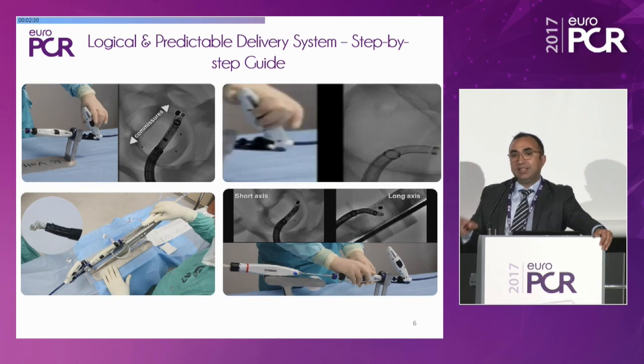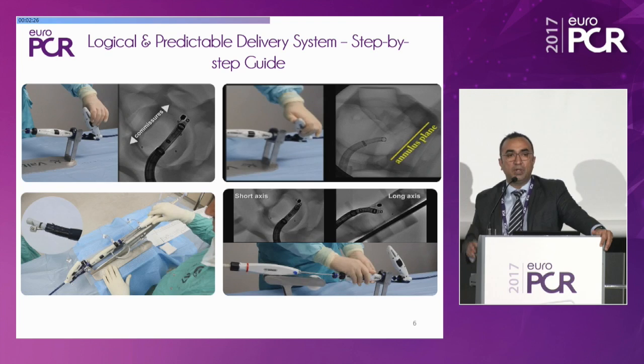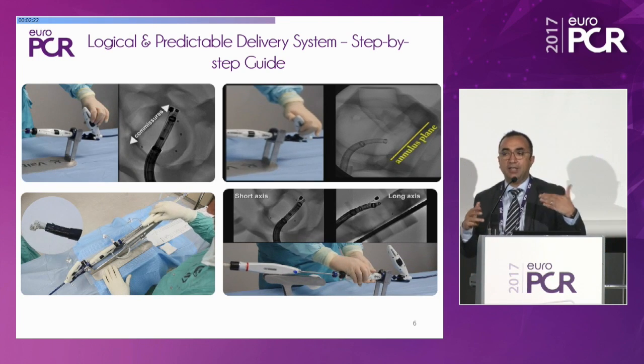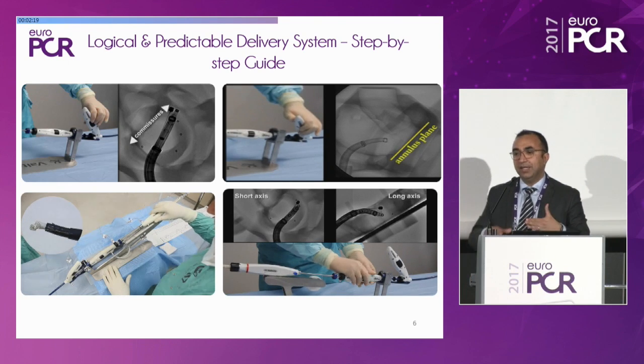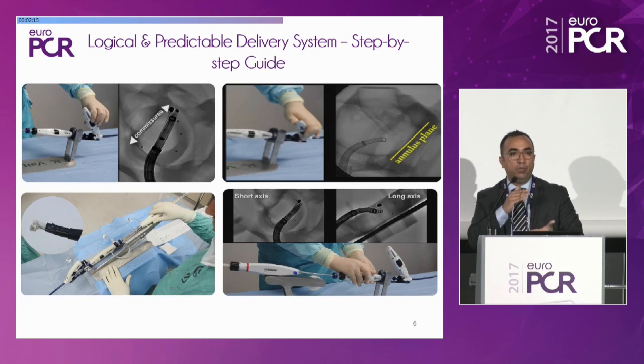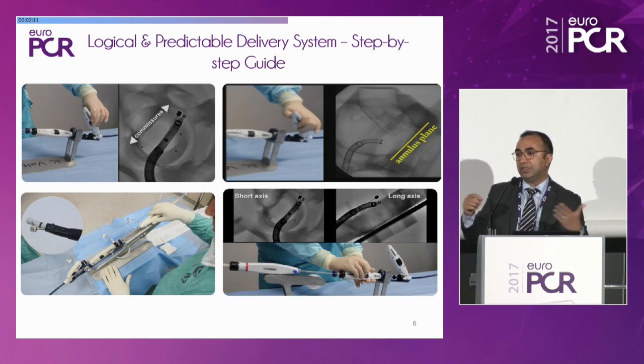And the reason I think this is really learnable is because it's reproducible. So when I first started learning Cardioband, I said to them, someone learning to be a pilot can open a book and look at every single step. Okay, it's really reproducible. Taking off on a plane is reproducible. It's the same steps you do every single time.